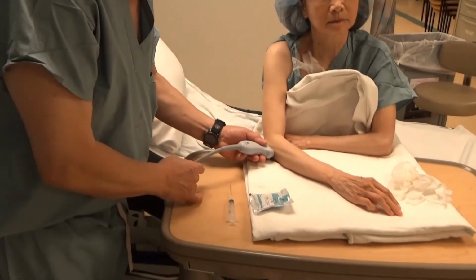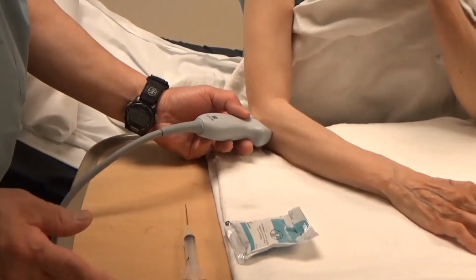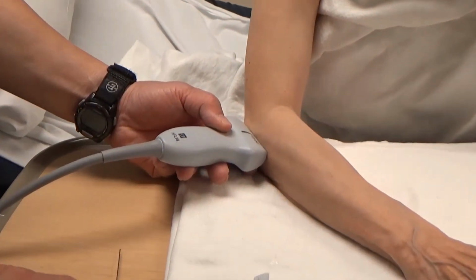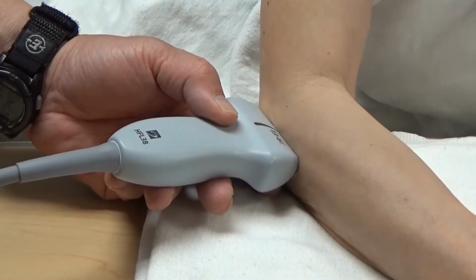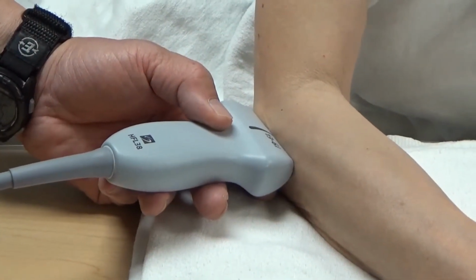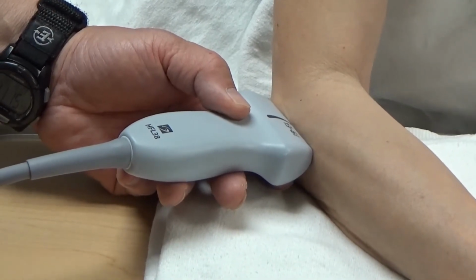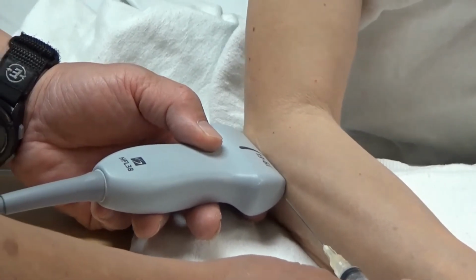So if you look at the transducer position, and could you please come and show this a little more closely? I wanted to mention that using the in-plane technique, which is typically described, is technically very, very difficult. When we describe the technique, most people describe it in this approach.